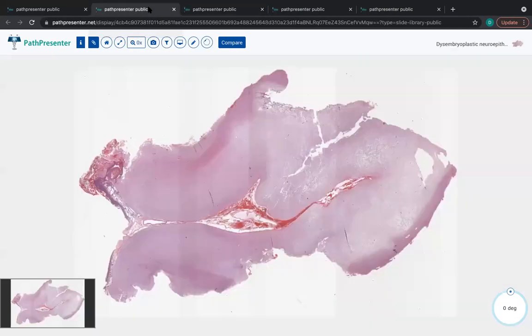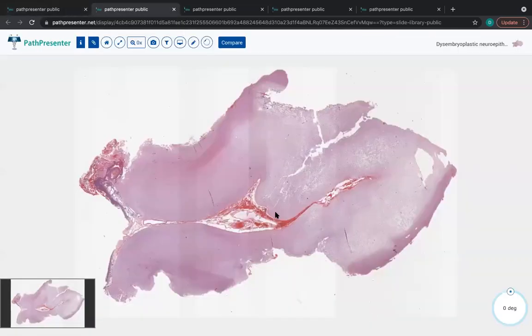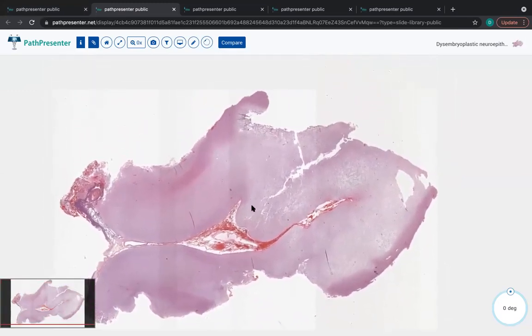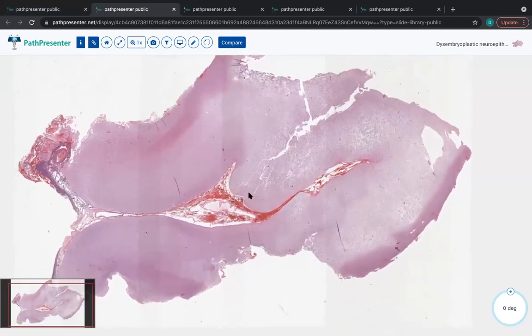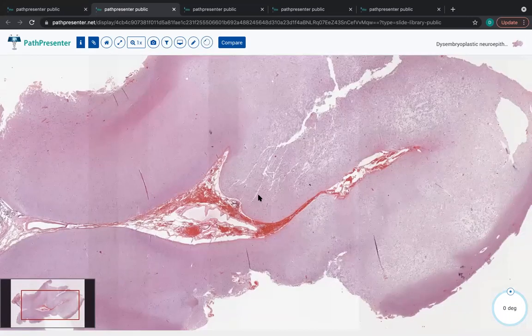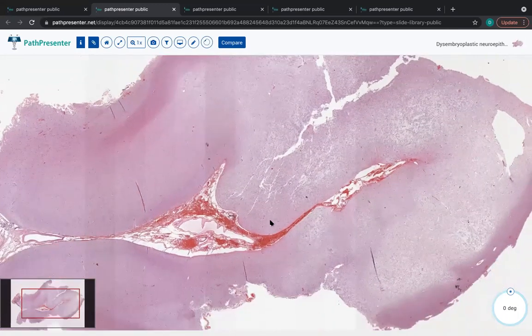As we're running a little short of time, I just want to cover a couple of other tumor types. So now we're going to discuss a dysembryoplastic neuroepithelial tumor. It's an unwieldy diagnosis, also known as a DNET. This is one of the very characteristic epileptogenic tumors. So these patients are usually younger patients, children, teenagers, young adults. They usually present with a history of seizures that's medically refractory.